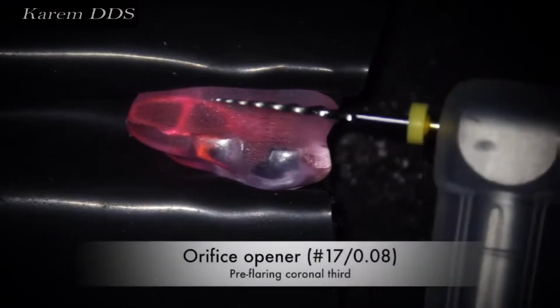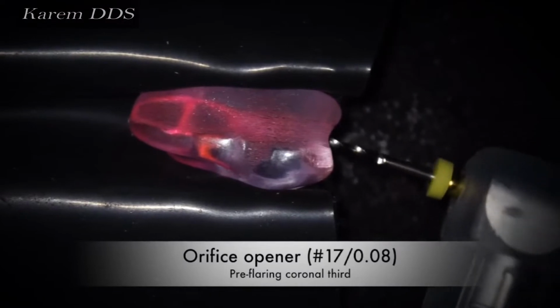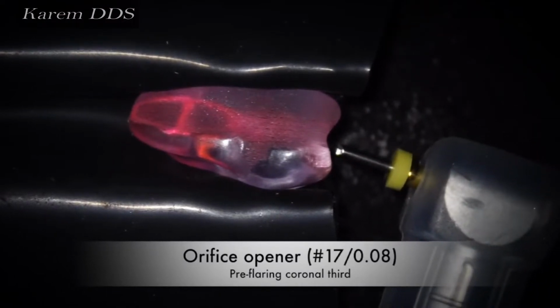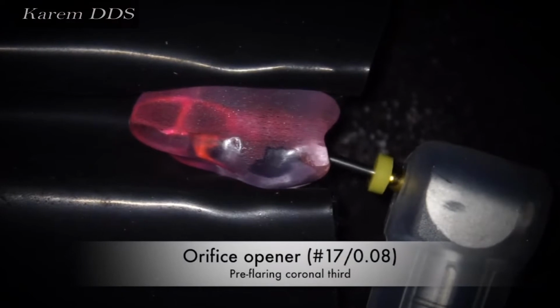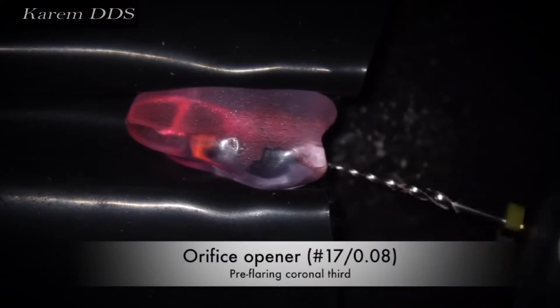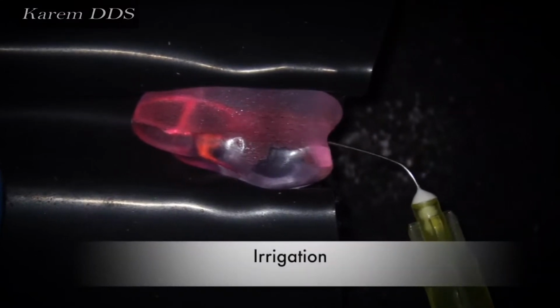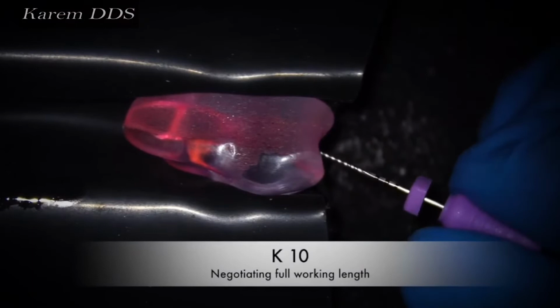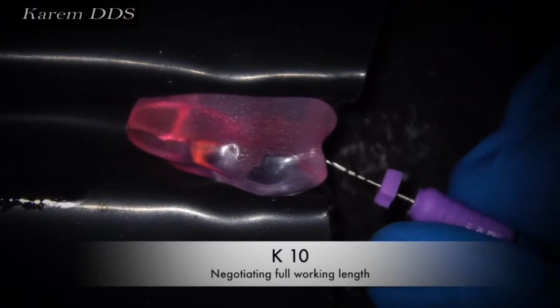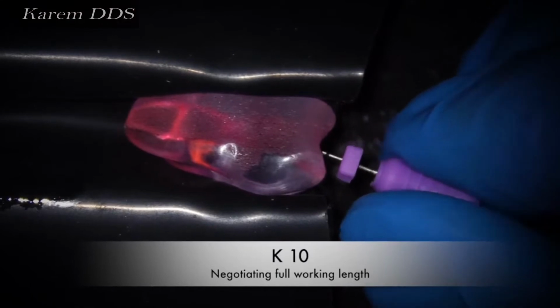Dividing the root canal into three regions is a helpful strategy for instrumenting complicated, calcified root canals with a challenging morphology.